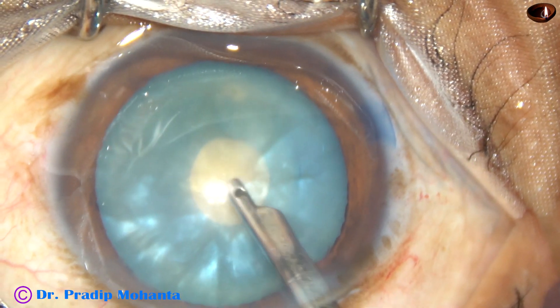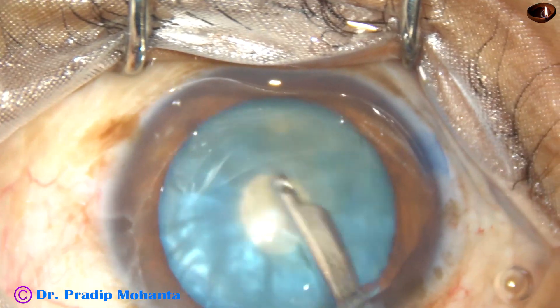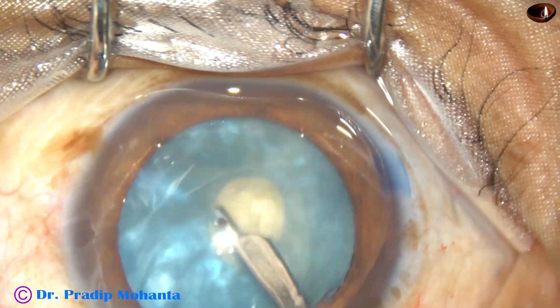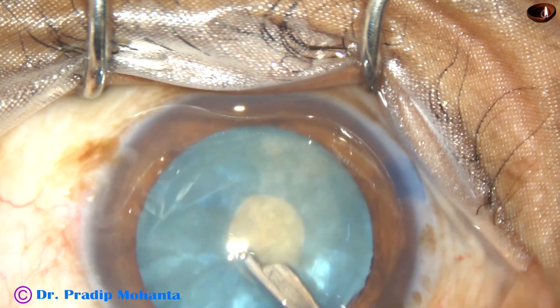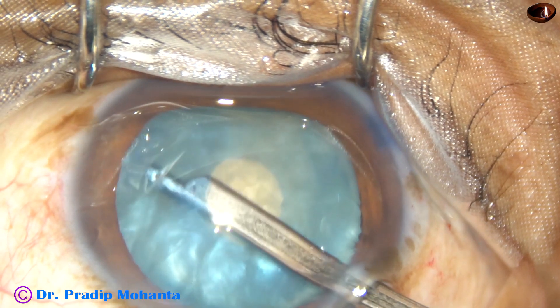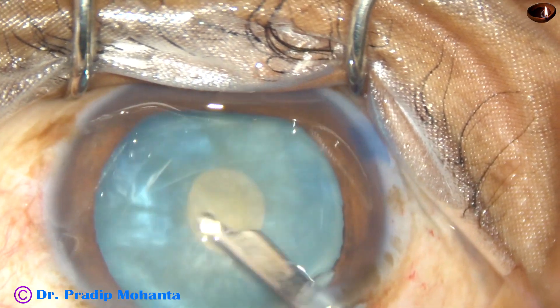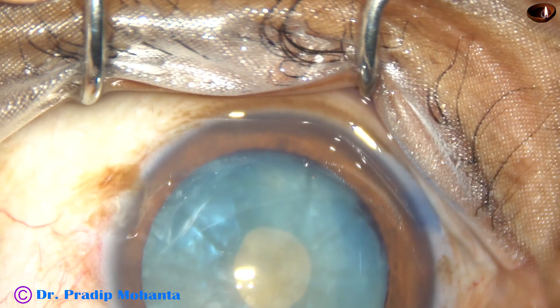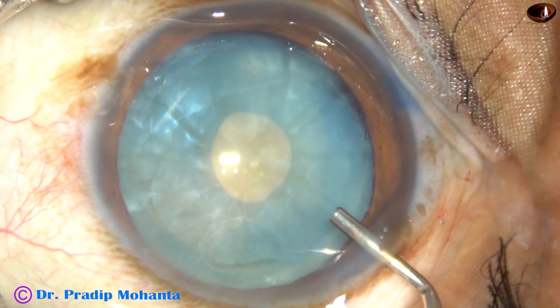And now, the intralenticular pressure has to be reduced thoroughly. I give adequate time to remove some cortical matter and decrease the intralenticular pressure. You can just irrigate inside the bag by the irrigating probe of bimanual IA. Just by irrigation, a lot of cortical matter may come out. I'm using a SIMCO, which provides irrigation, and whenever required I can use the aspiration.